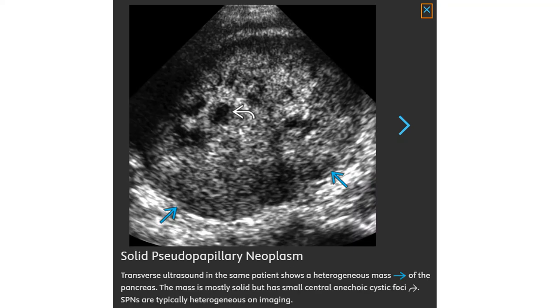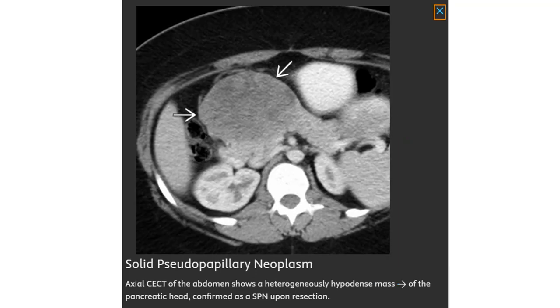Ultrasound of the patient shows a heterogeneous mass of the pancreas; the mass is mostly solid but has a more central cystic component. Solid pseudopapillary neoplasms are typically heterogeneous in appearance on imaging. Contrast CT of the abdomen shows a heterogeneously hypodense mass of the pancreatic head, confirmed as a solid pseudopapillary neoplasm upon resection.